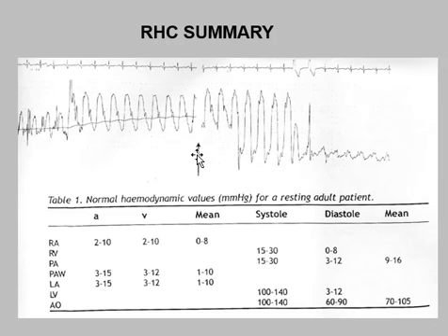And at this point is where the thermal dilution connector is introduced and the cardiac output by thermal dilution technique is activated. Normally we do several measurements, 3 to 5, and the values can vary by up to 10% usually. But to be within a reasonable limit of statistical accuracy, you must record the average of at least 3 values that lie within 10% of their mean. And that's not always easy. We'll have a look at some of those, or the potential variety in values, down the track.